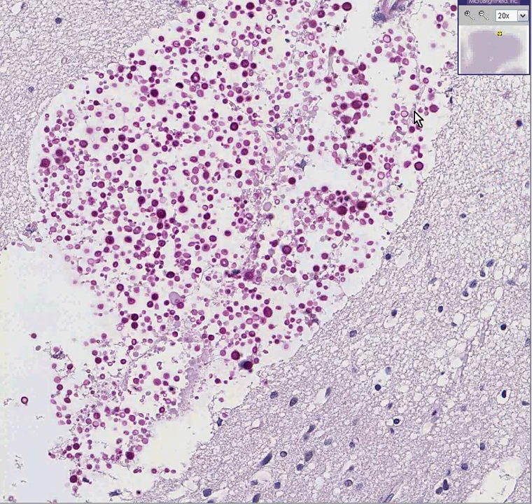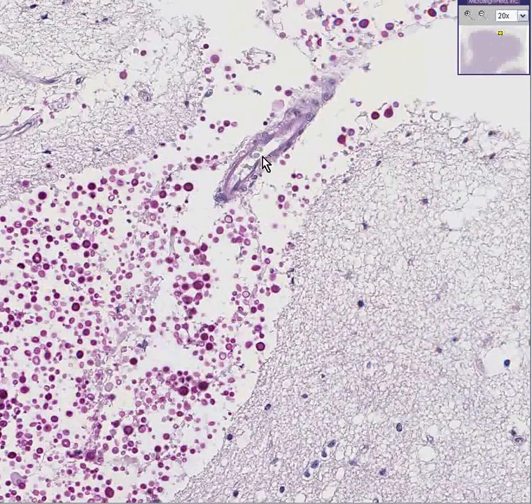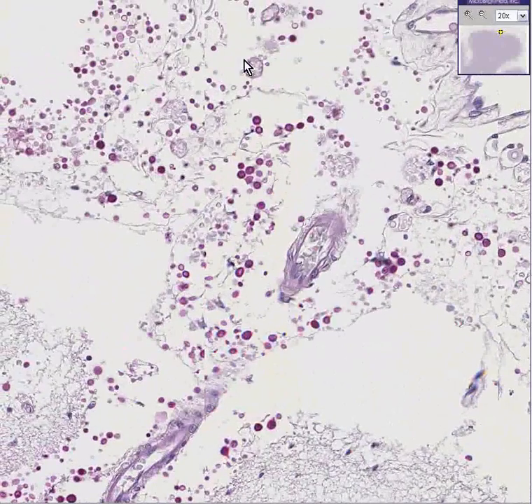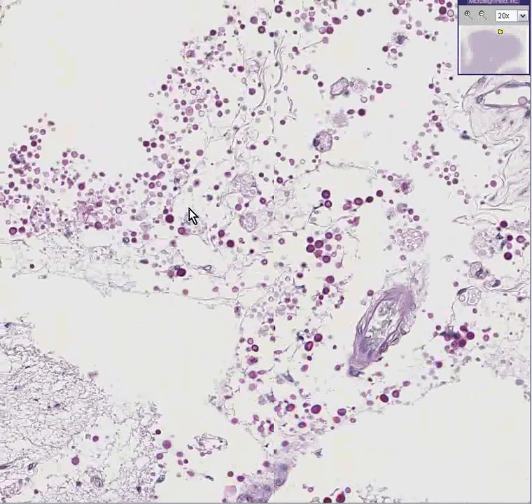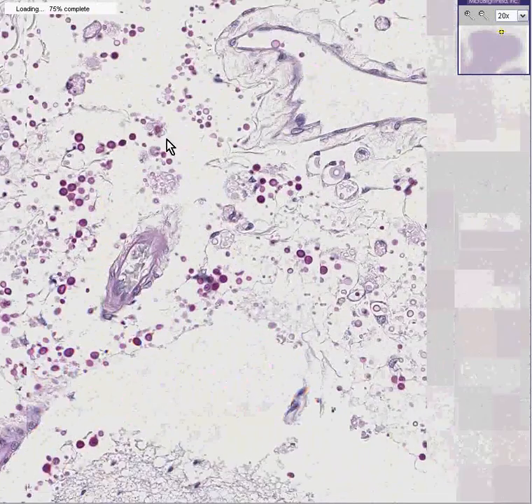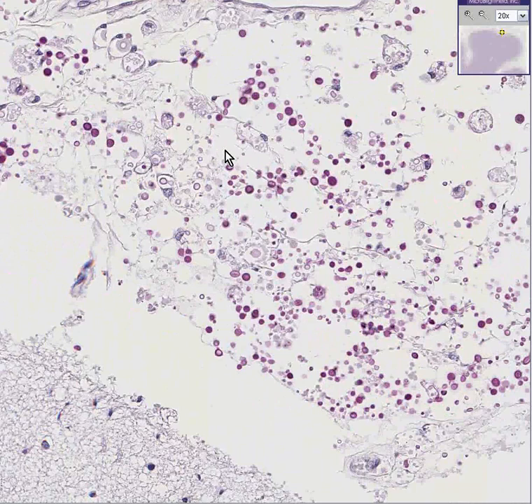Look at all these little yeasts taking up the PAS stain. Some of them have little buds — do you see that? Some of them don't have buds. They appear to generally be around blood vessels, and they also appear to diffusely as well as focally involve the meninges as well. This is a yeast that's infecting extensively the meninges and brain substance.